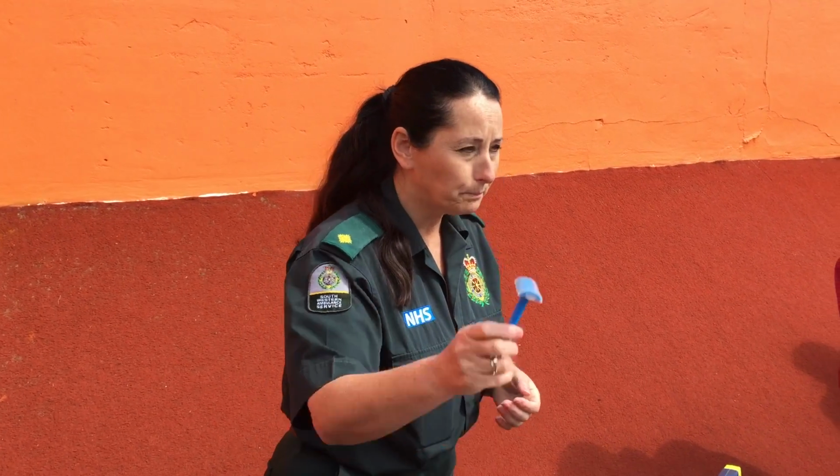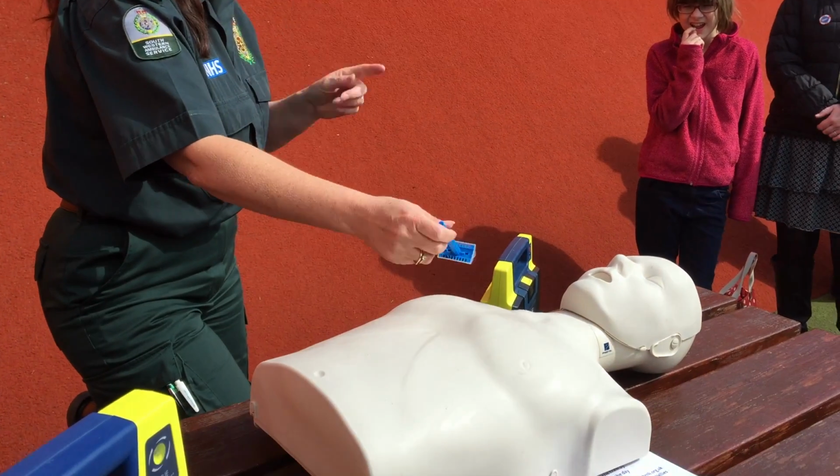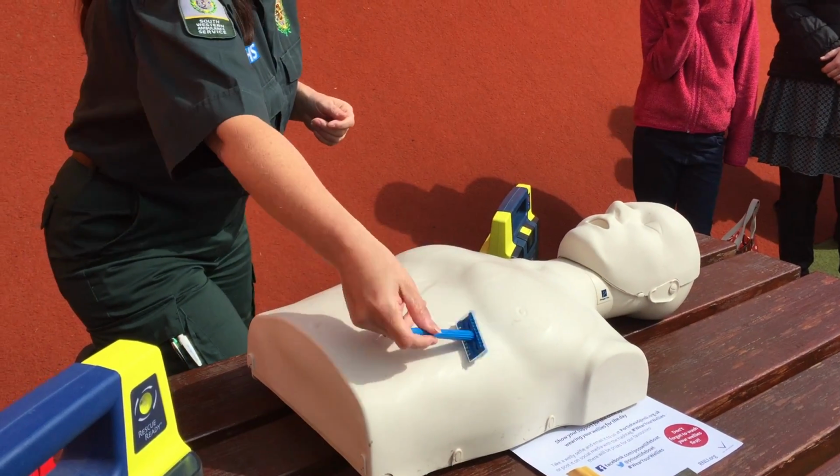Well, no, you can try. Yeah. But most of the time, the defibrillators, even the public access defibs in the cabinets, they've all got the rescue packs, and they've all got those things in there. Good, yeah, okay. So you will shave the chest where the pads go, which I'll show you in a minute, which is here and here.